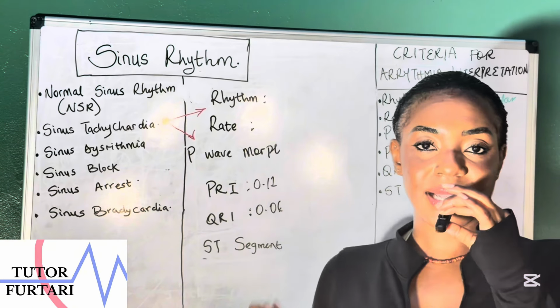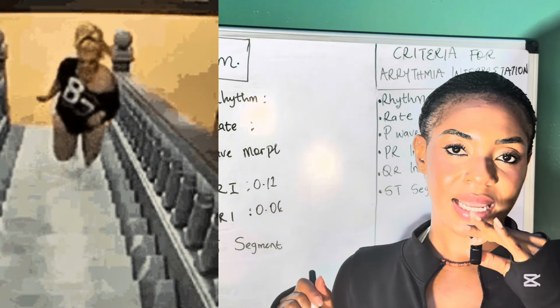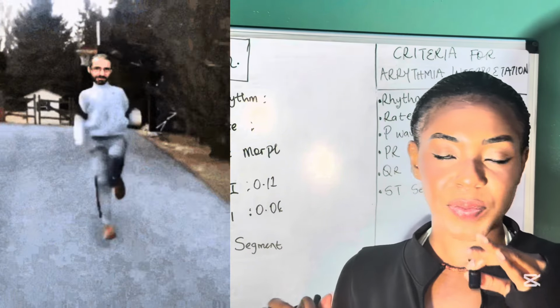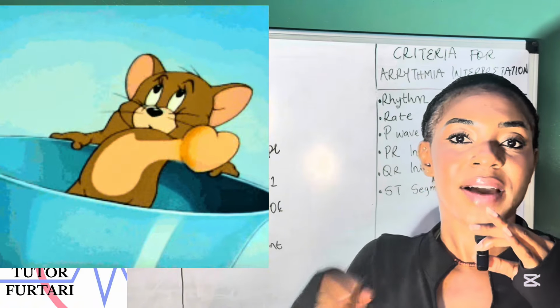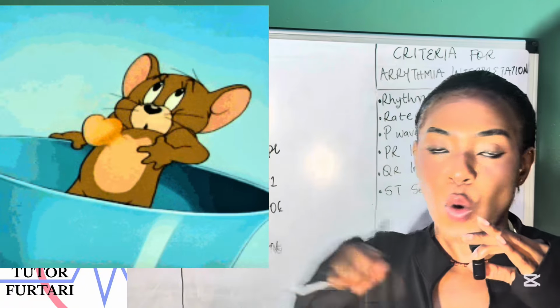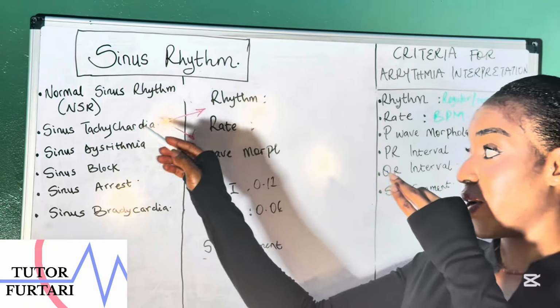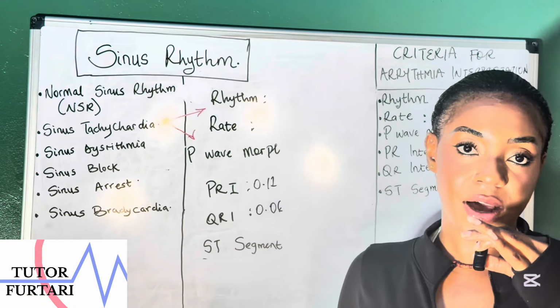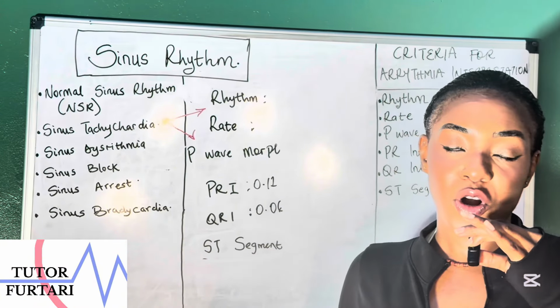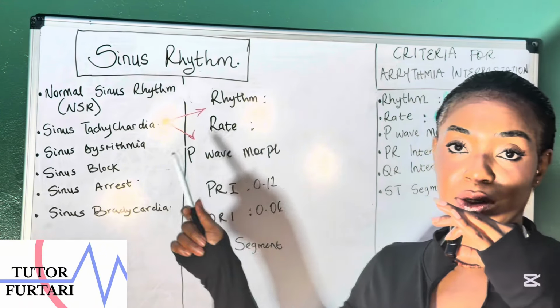So, what is a sinus tachycardia? You know, when you run up the staircase after a lot of exercise, or maybe when something scares you and you have this rapid heartbeat, your sympathetic nerves are going off. It's triggered. Your heart is beating. Yes, you are experiencing sinus tachycardia. That could be a factor, or maybe medication, or maybe even an underlying health issue could lead to sinus tachycardia.